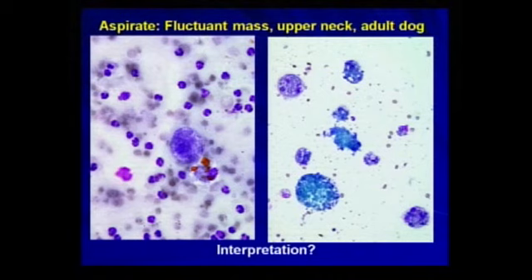So in sialoceles, you will see mixed inflammation, a lot of macrophages, which will either have these orange hematoidin crystals or these bright green crystals. And perhaps this is hematoidin that's broken down a little more. But a nice Kelly green. I don't know of anything else that looks like that. So this is the cytologic appearance of a sialocele.